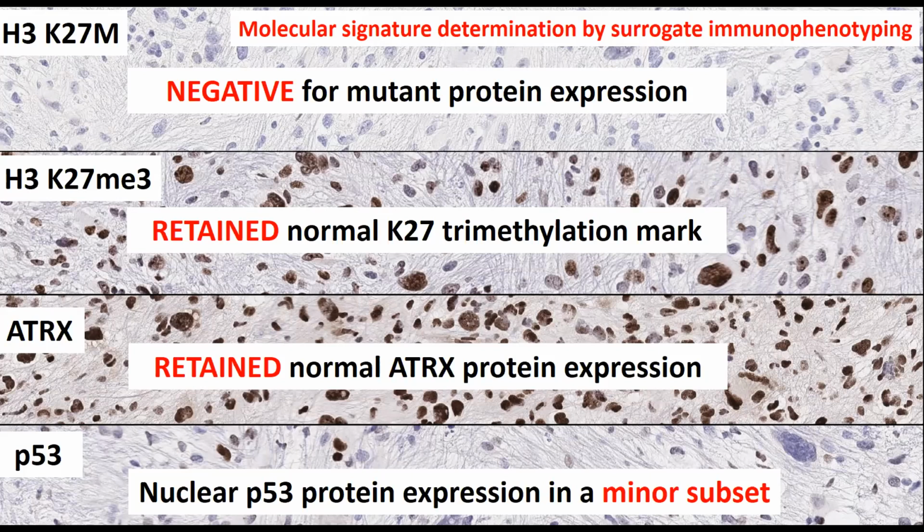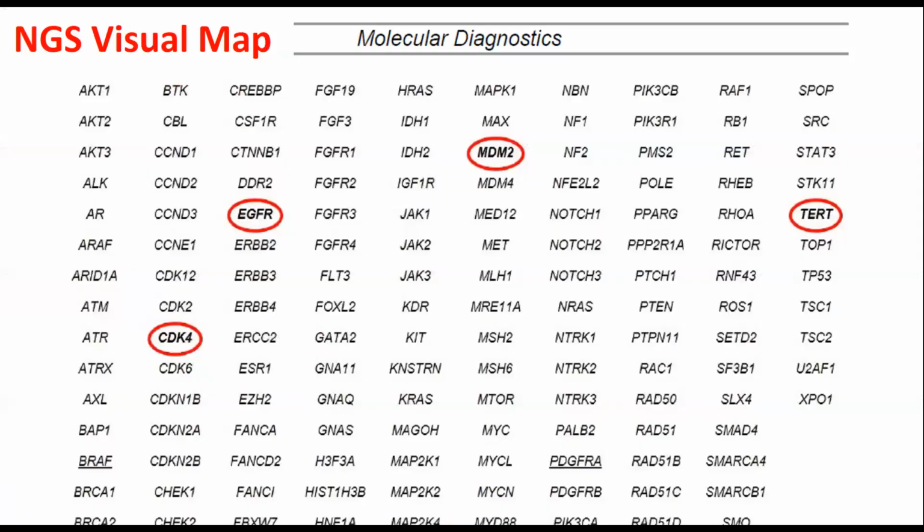When the protein is mutated, not always, but in a large percentage of cases, the mutated protein is stabilized. It hangs around, and we visualize that with an antibody to the normal protein as strong, positive, high percentage nuclei. Now, you have to know the difference between the staining patterns of the antibodies. That is the whole key. I'm telling you there's a lot of misconception in the community, and these stains are misinterpreted frequently. Okay, here we go, moving on.